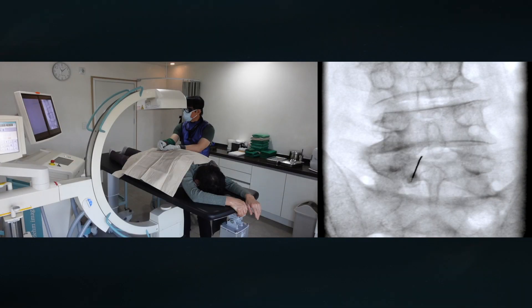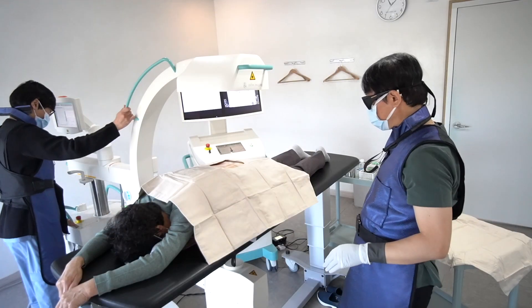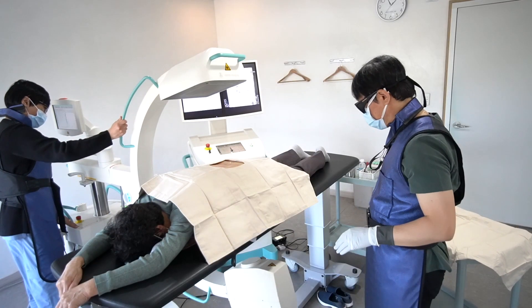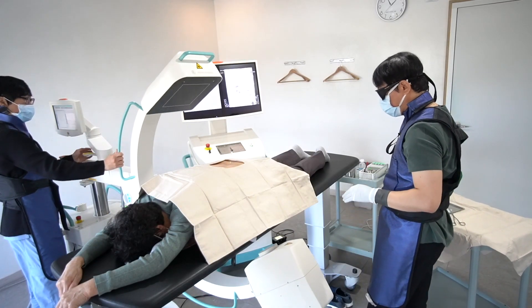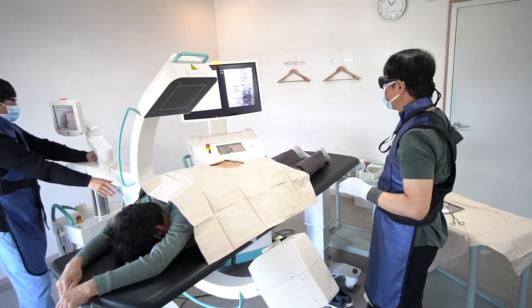How much do I advance the needle on AP view? I rely on the patient's body mass and the sense of my fingertips. And then I rotate the C-arm to the contralateral side.